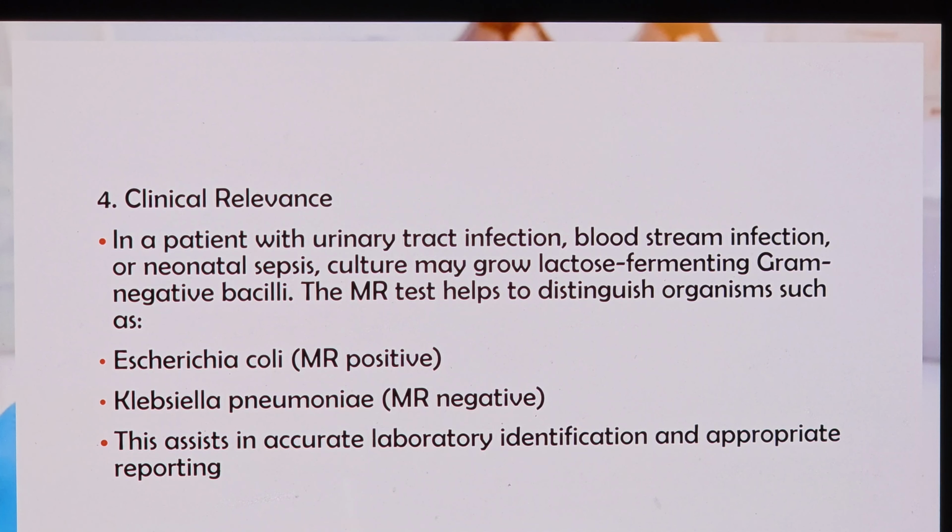Clinical relevance. In a patient with urinary tract infection, bloodstream infection or neonatal sepsis, culture may grow lactose fermenting gram-negative bacilli. The MR test helps to distinguish organisms such as Escherichia coli, MR positive, Klebsiella pneumoniae, MR negative. This assists in accurate laboratory identification and appropriate reporting.